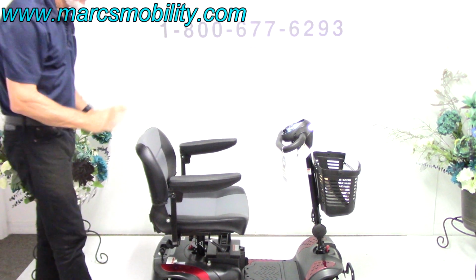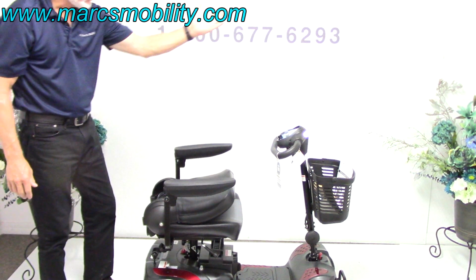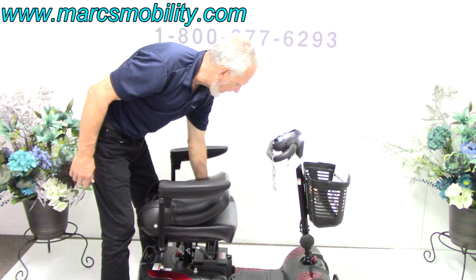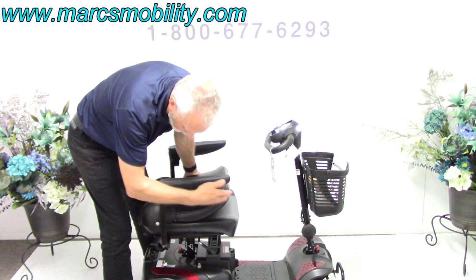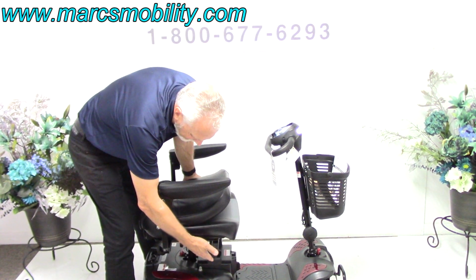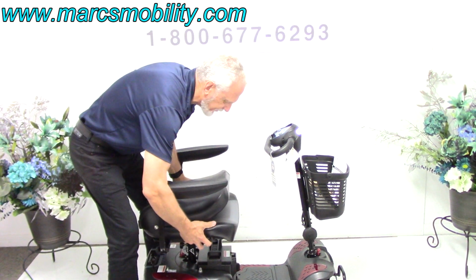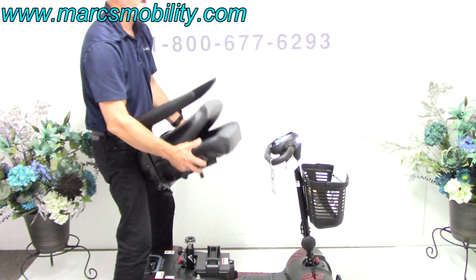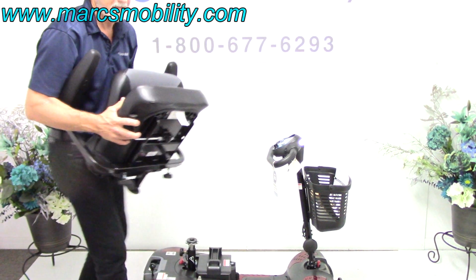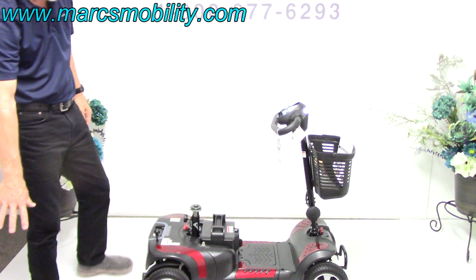When you take it apart, the first thing you would do is fold the back of the seat down. Put your left hand under the seat right here, not over like this, through the arm, and then with this one you can go over the seat. You must lift this lever. Lift it up, and you can see how it unlocks the seat, and then pull straight up. You notice how easy that was? Don't pull back. If you pull back as you're pulling, it's not going to come out. The seat weighs about 25 pounds right there.